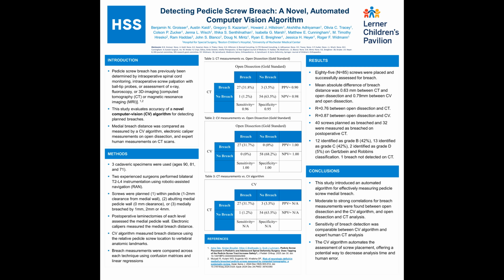Postoperative laminectomies of each level assessed the medial pedicle wall. Electronic calipers measured the medial breach distance. Computer vision algorithm measured breach distance using the relative pedicle screw location to vertebral anatomical landmarks. Breach measurements were compared across each technique using confusion matrices and linear regressions.